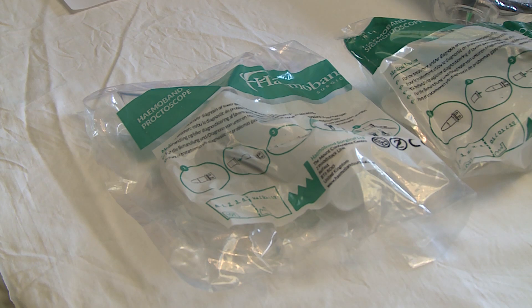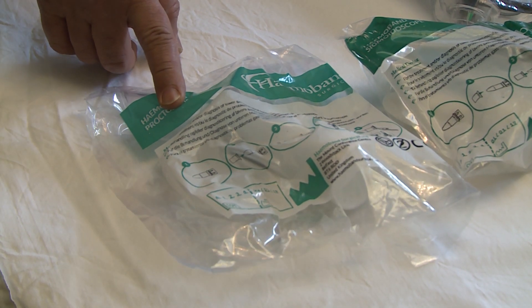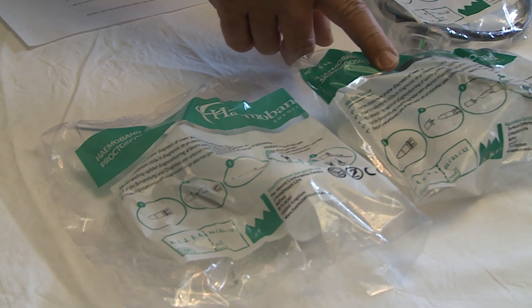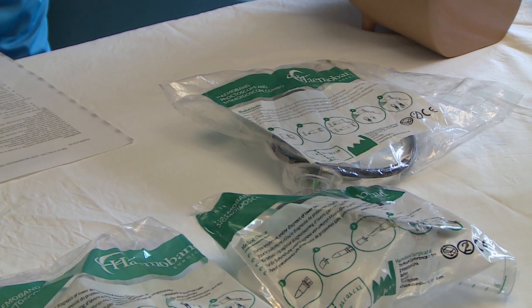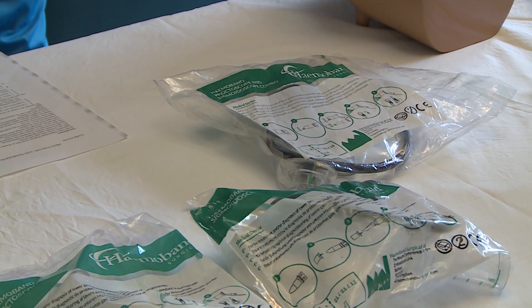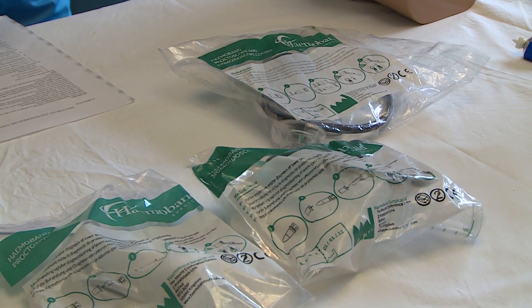We provide this system in three forms: a proctoscope-only set, a sigmoidoscope-only set, and a composite set. The clinician will decide according to the clinical situation which package to use. The price difference between sets is not great if a different choice is made.